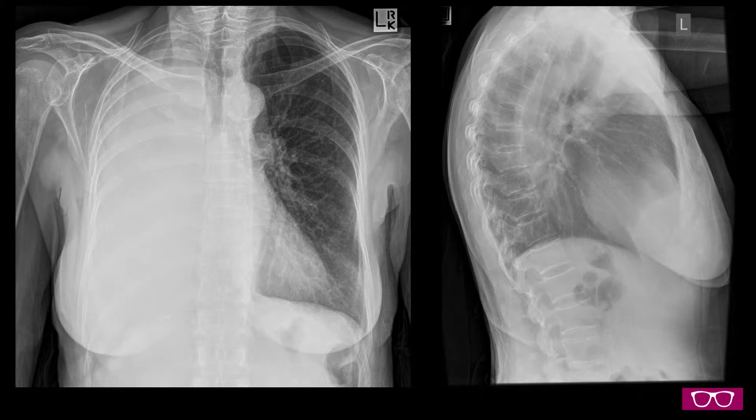This is a case that you will encounter as a common set piece for chest films — a case of a hemithorax whiteout. They seem simple on the surface, but there is a lot of extra information that can be gained from working through these images, especially in terms of getting the CT up and being able to come down on a clean diagnosis and wrap up the case quickly.